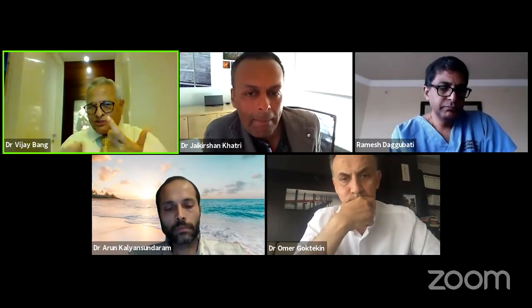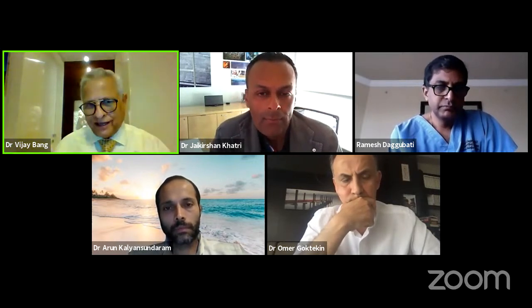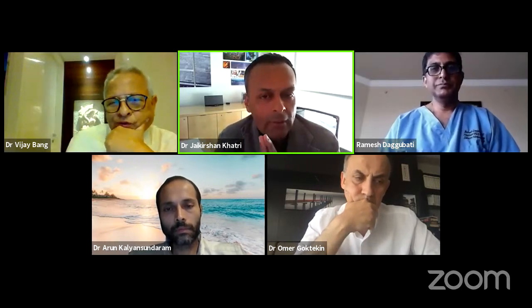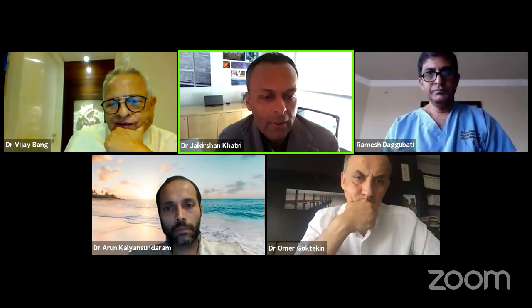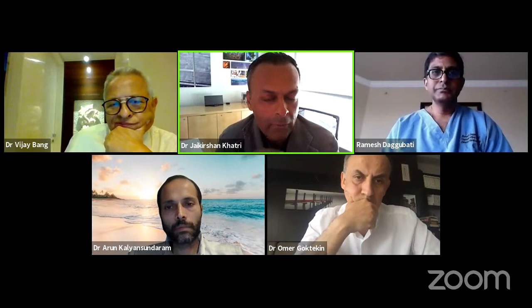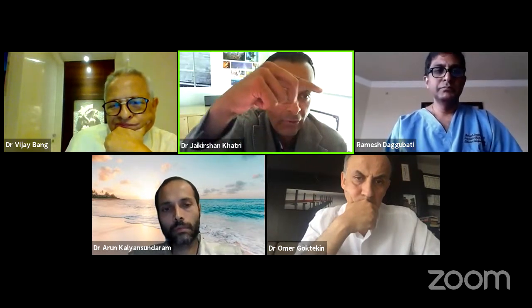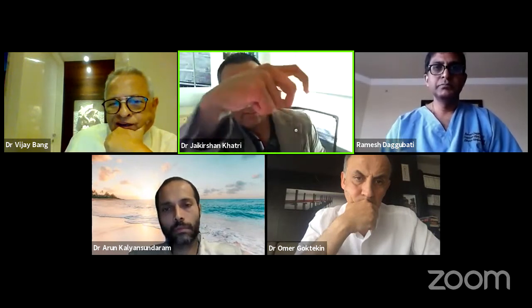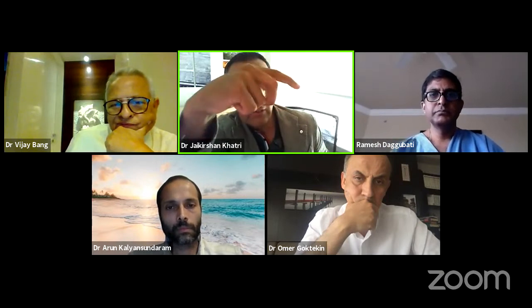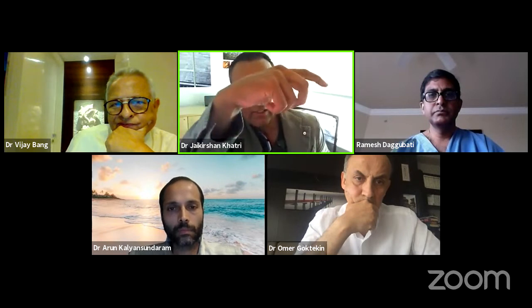Can you explain a little bit about this wire thing? Of course, it is a lot of personal tactile thing, but apart from tactile. So number one, you start with a soft polymer jacketed wire. There is no tactile feedback, zero, with a soft polymer jacketed wire. It's purely visual. The wire is going to go straight with no deflection, or the wire is immediately going to deflect like this. The minute the wire deflects like this, I tell the fellow, you either change this wire or pull back and try again. If the wire goes straight, then you're okay. If the wire keeps doing this, we're done.